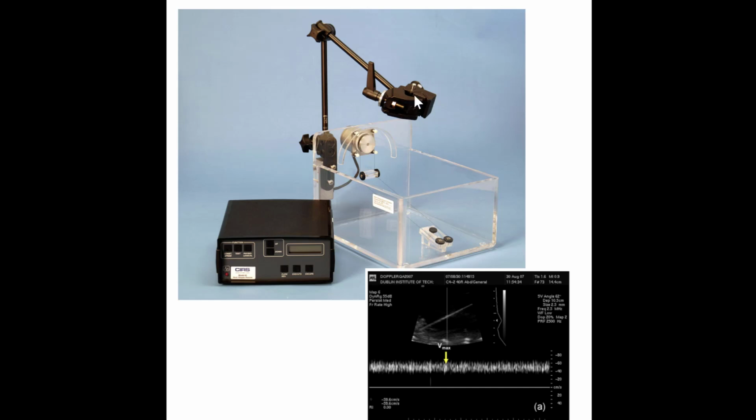What we are seeing here is a transducer holder. So the transducer would be holding this. There would be water in this basin here, and then we would turn the motors on, and these strings would start to vibrate. And the vibration of the strings would cause motion that would be detected by the ultrasound equipment, and then we'd be able to see that in our spectral tracing. So here you can see where the string is, and we can see the pulse wave line coming down with the gate placed directly over the string. And then again, we just have steady flow, or what's mimicking steady flow, and so we can see that in the window here.